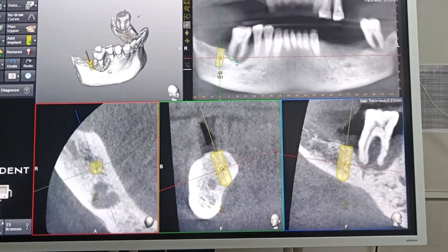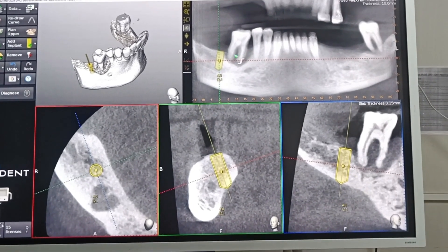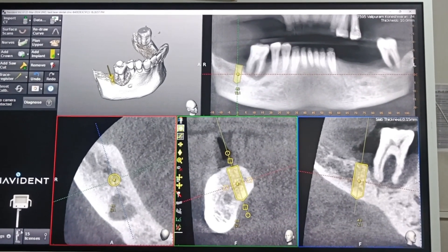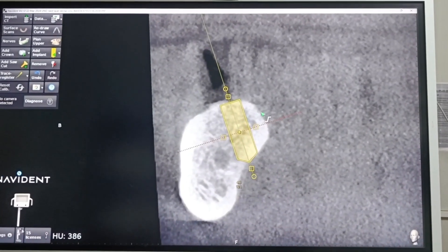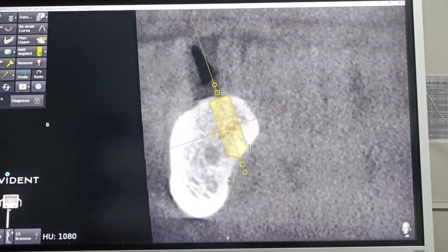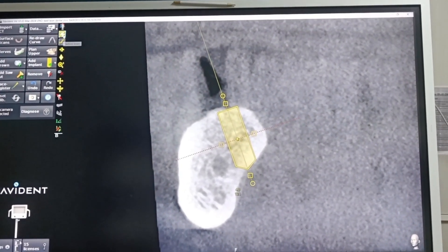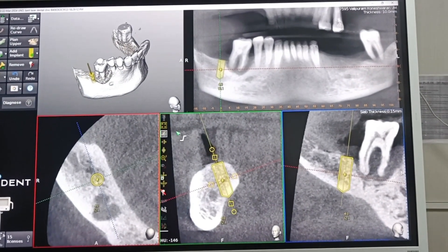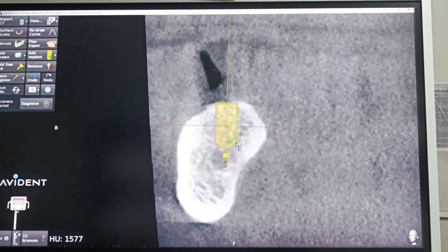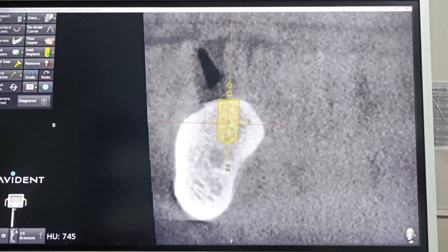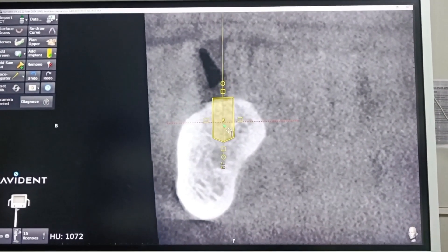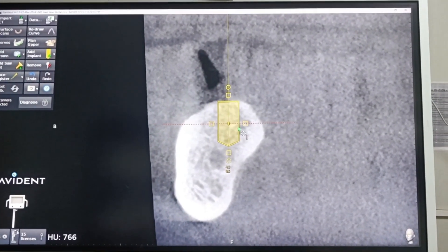We will make an incision here. Since we are going to curettage here anyway, just another 1 centimeter incision distally will expose the crestal part, and we can drill. You can also do it without opening a flap by experience. Alternatively, drill straight without planning any lingual perforation — plan for a shorter 8mm implant, drilling a bit closer to the lingual side rather than buccally. Both options are available.